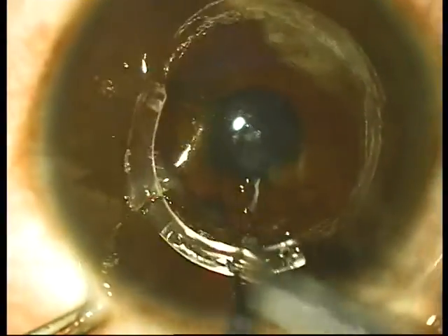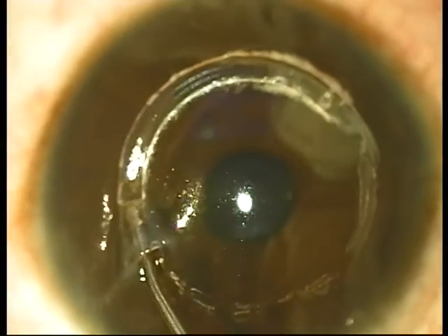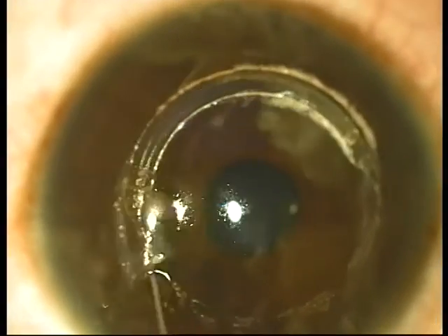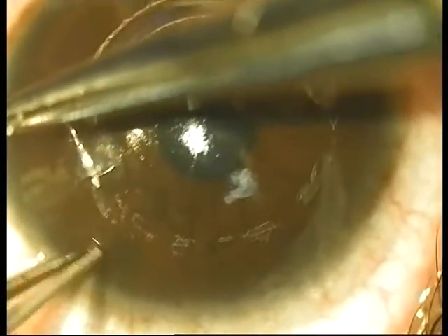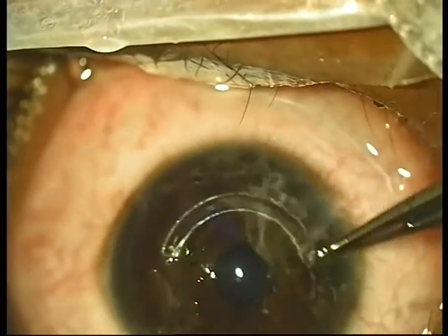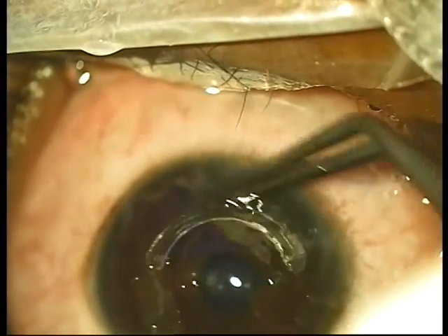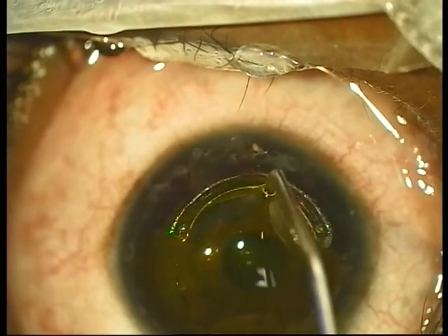The femtosecond laser-assisted channel has already been created and the INTACS segment is inserted into the channel. This is a 0.40 segment, and it is then nudged in to lie in the inferior quadrant in such a manner that it supports the cone from inferiorly. The entry incision is then sutured tightly in order to get a second limbus effect, which regularizes the topography and pushes the cone more centrally.